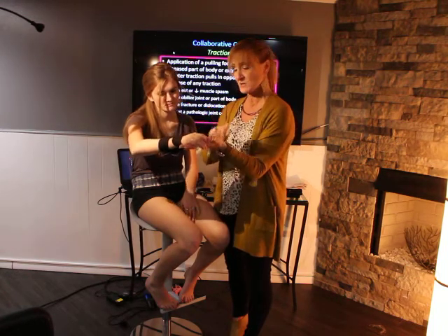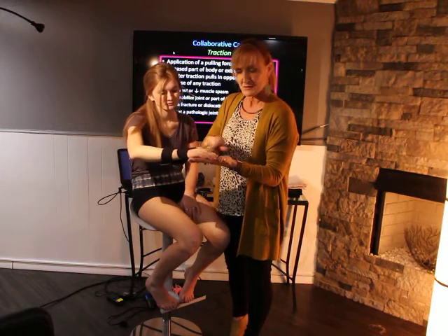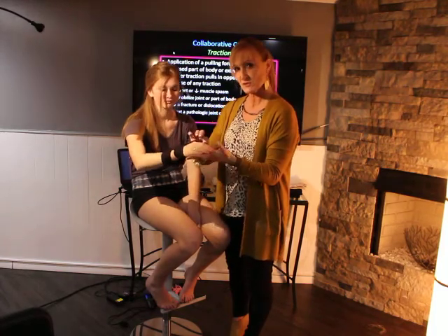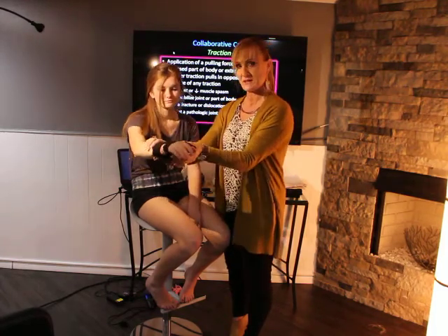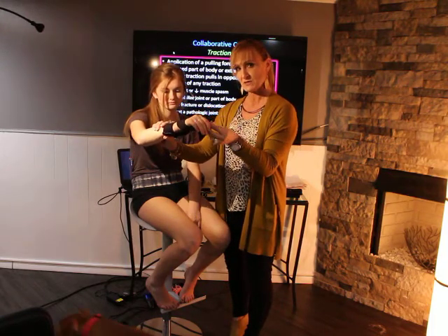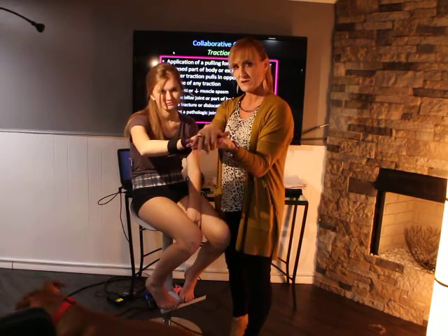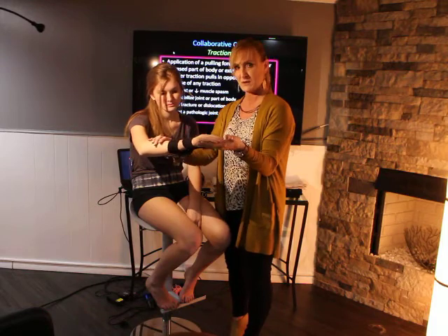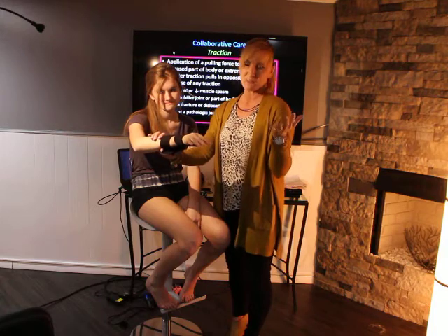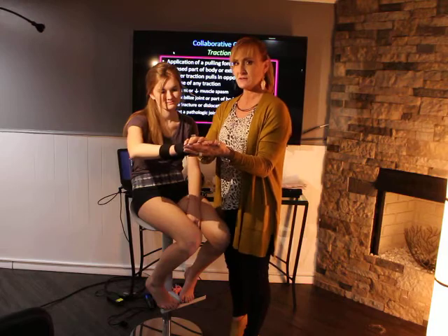What you're also going to watch for at this point is the swelling and, what am I trying to say? Vascularization, the blood vascularization down in here. So now that you've got this joint that is traumatized, I'm going to assess the distal thumb to make sure that it's warm, that I'm getting good blood supply there, as well as in these fingers. And periodically, you're going to have your patient just move their fingers. Can you move those fingers for me? Assess pain, treat them for pain every 6 to 8 hours, and that should start getting better.